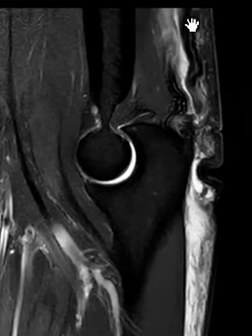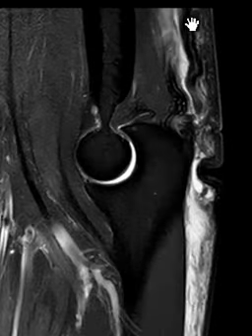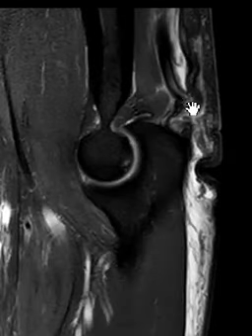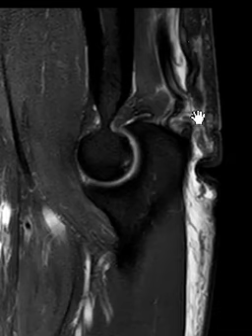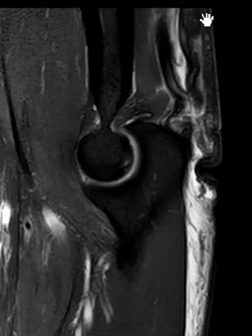That central tendon is made of two components. It's made of the long head and lateral head. It comes down here, and it's the superficial one. We can see that's the one that's torn. It comes down here, it's wavy, and right near the attachment, there's a little band. This is a little intact component right at the olecranon attachment, but right here there's a little tear, so a ruptured component here. Again, this is the superficial component from the long head and lateral head.